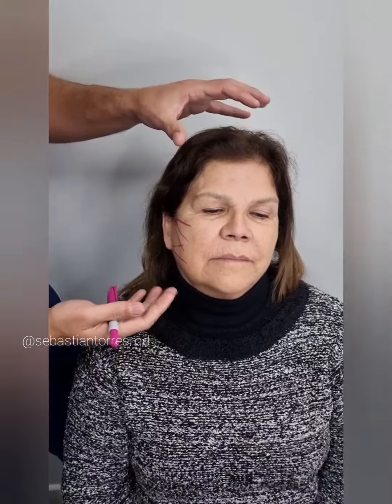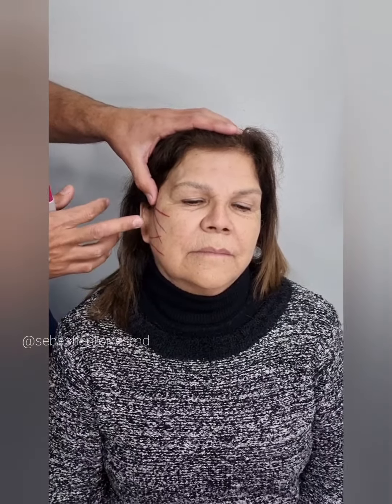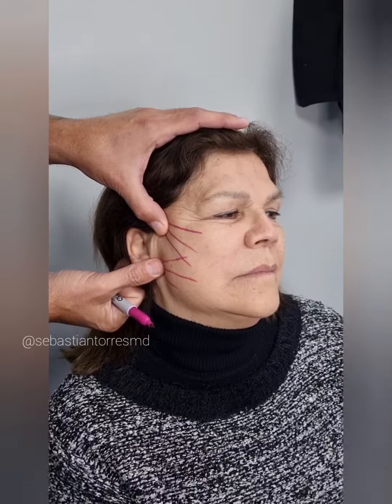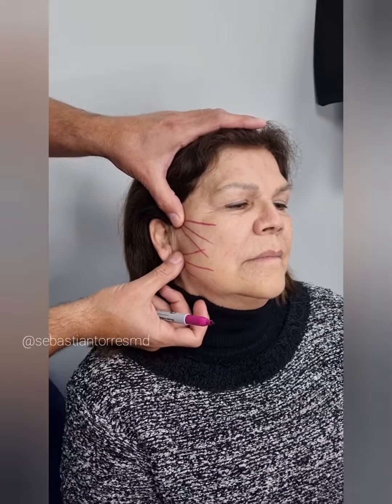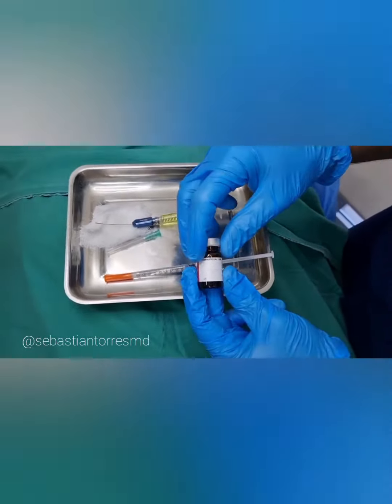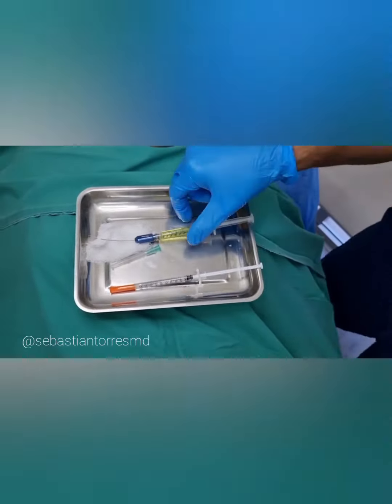A 55-year-old patient with sagging skin. We will perform a cell booster lift using Hyperline through two entry points with a cannula, to favor lifting of the tissue with the active principles inside the solution. We have our Hyperline cell booster lift solution prepared in a 3ml syringe.